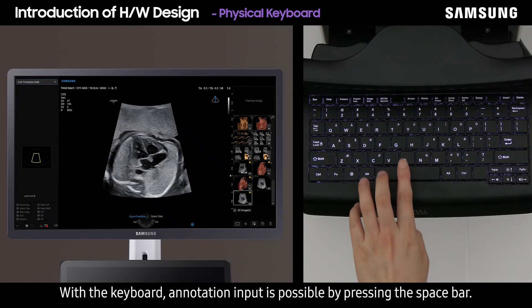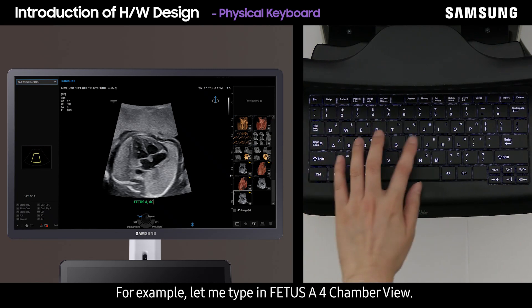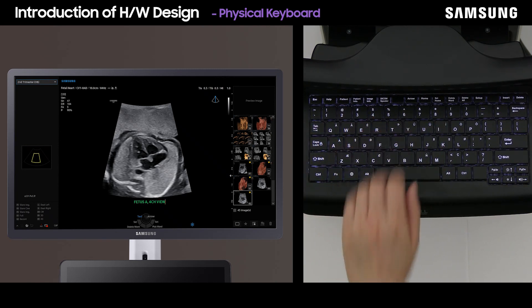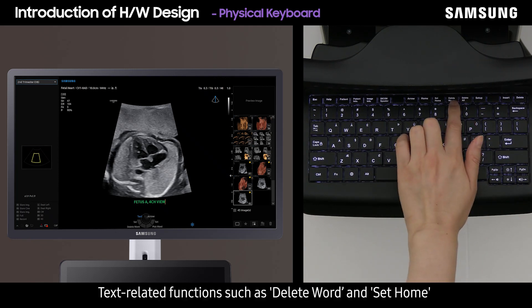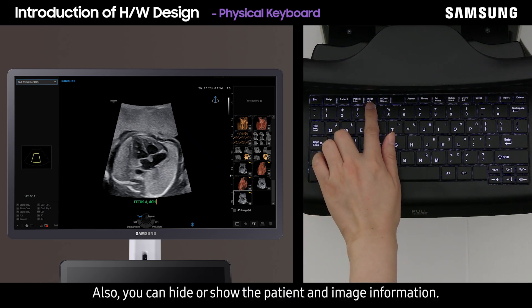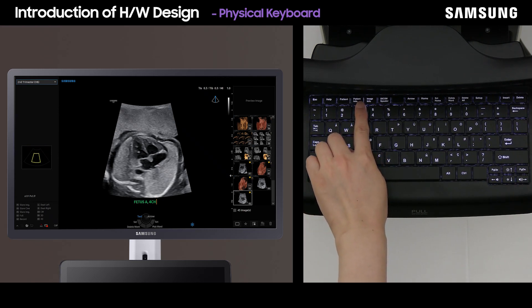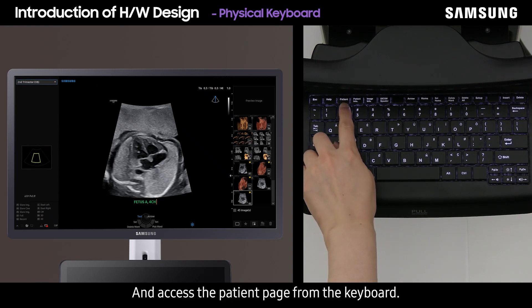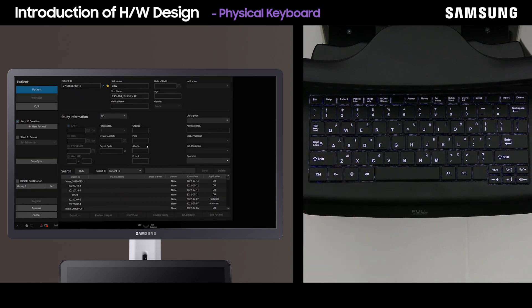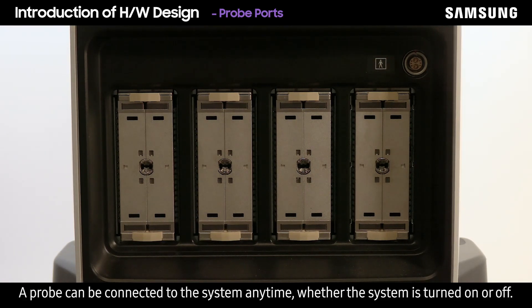With the keyboard, annotation input is possible by pressing the space bar. For example, let me type in 'fetus A four chamber view.' Text-related functions such as delete word and set home can be executed on the keyboard as well. You can also hide or show the patient and image information, and access the patient page from the keyboard.